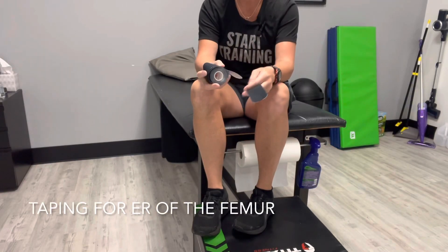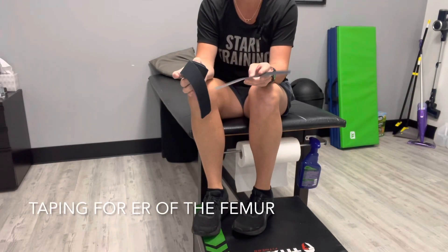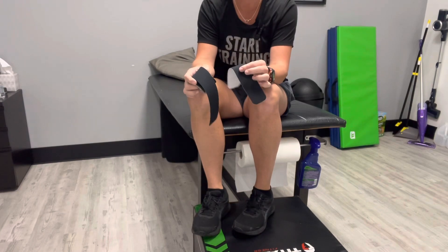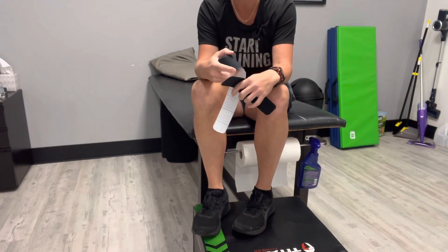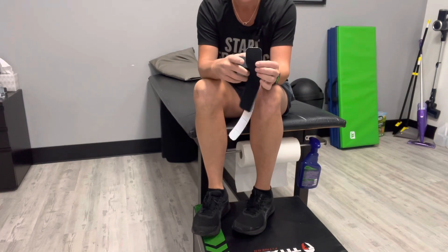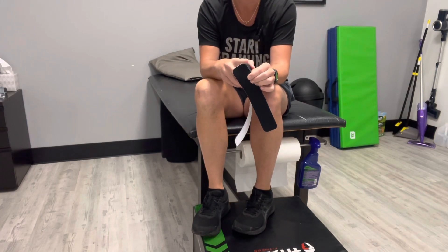With this tape job, we're going to use just pieces of Kinesio tape. These come pre-cut already. If you don't have pre-cut pieces, that's fine — just make sure you round the edges of the tape, since rounded edges tend not to peel up as easy.